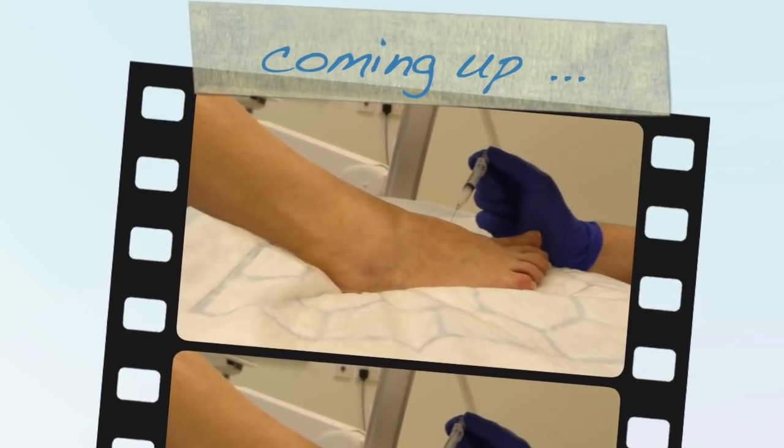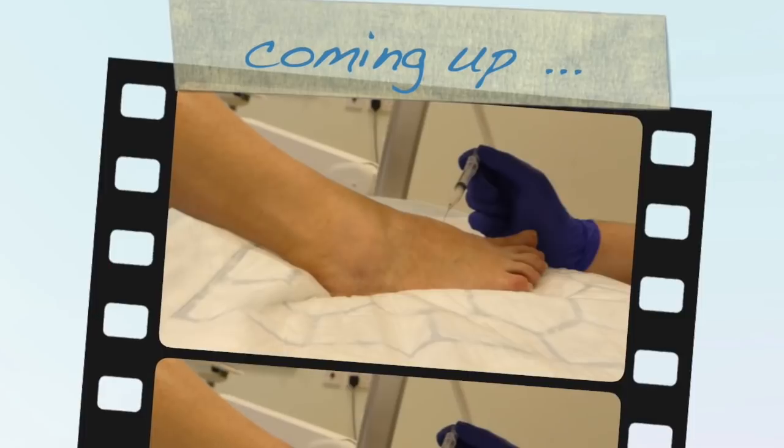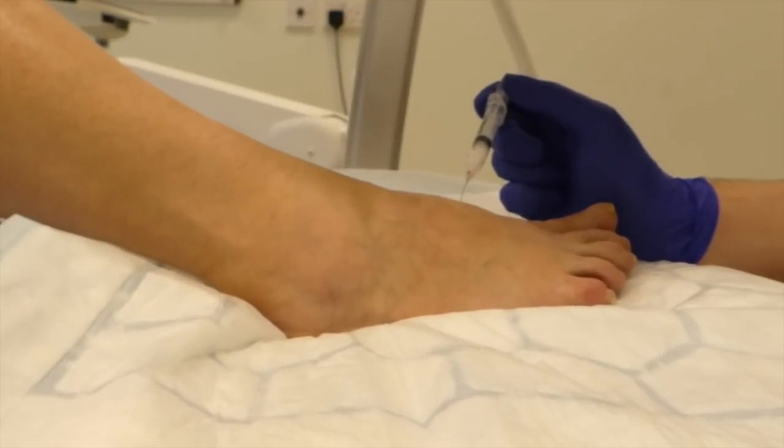We're getting some patient feedback now, which is a good sign. Can you see I'm in the joint there now? Can you see where that needle is?